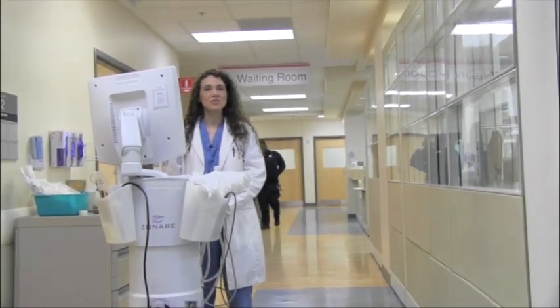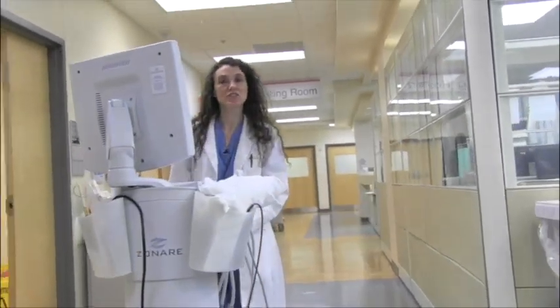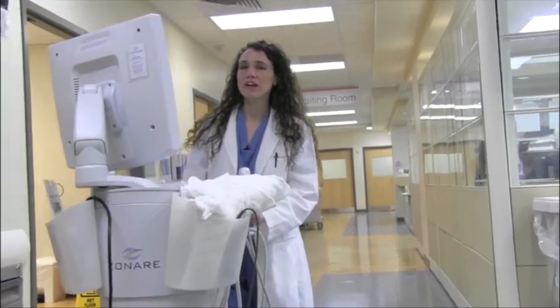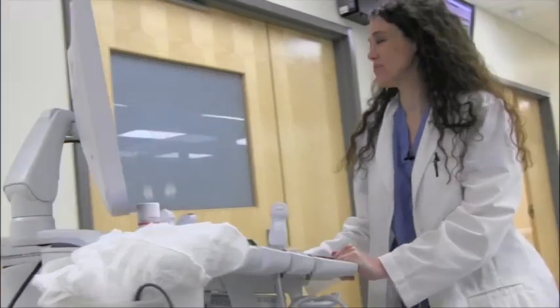Ultrasound is a fantastic tool to help you take care of the patient in your emergency department with undifferentiated shock. I have a 45-year-old patient who's come into the emergency department. He has chest pain and shortness of breath.